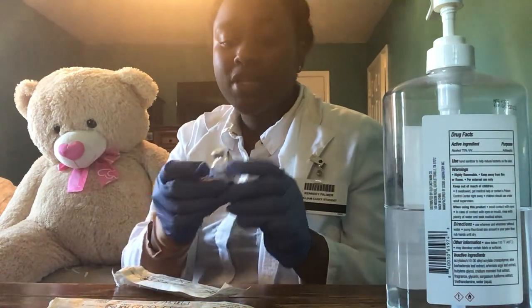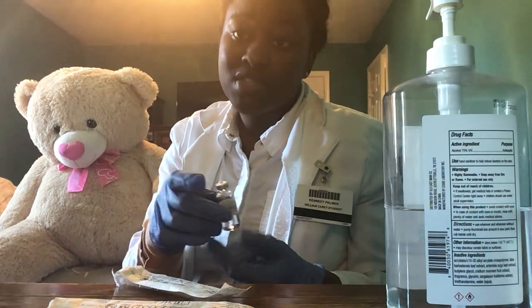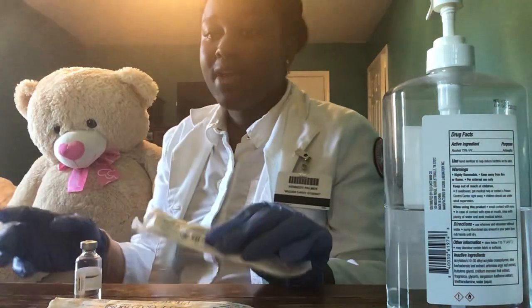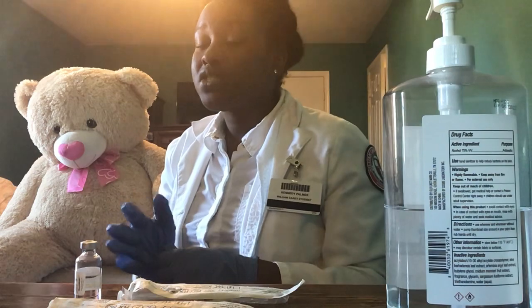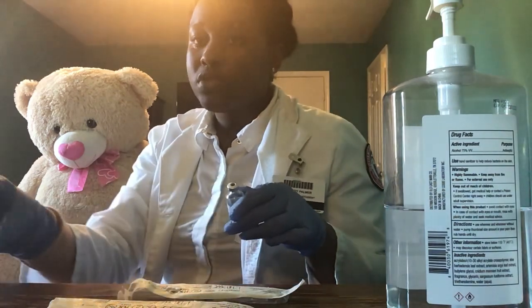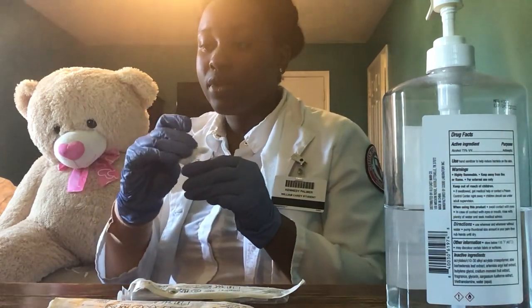I'm just going to check the expiration date, and I'm just going to check the MAR with the physician's orders again. I have my syringes here. For IM injections, you would use a 22 to 25 gauge syringe with a 1 inch to 1.5 inch needle. And so I am going to just pop the cap off and clean the vial.